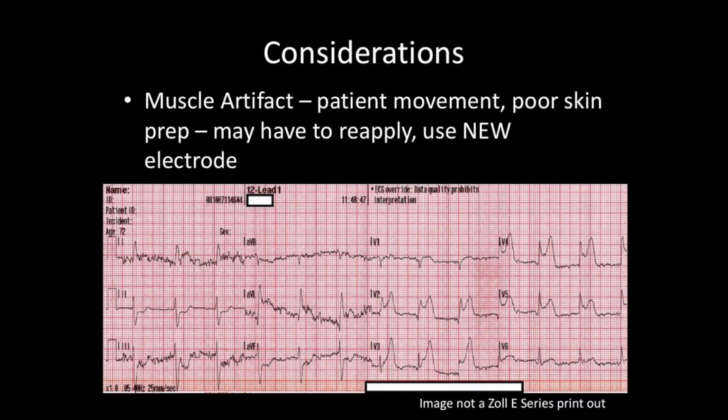The other thing I told the other group is, and I don't know if you can see this, if you look at just from here to maybe here, it looks like the side view of a fireman's hat, and that's one of the terms they give this, a fireman's hat. So this is the shield in front of the hat, this is the actual head part, right?